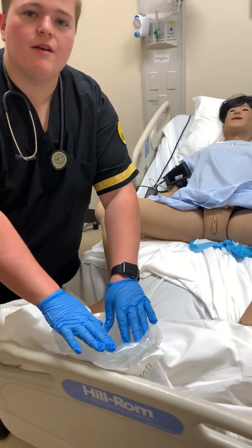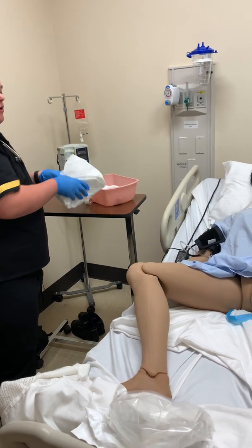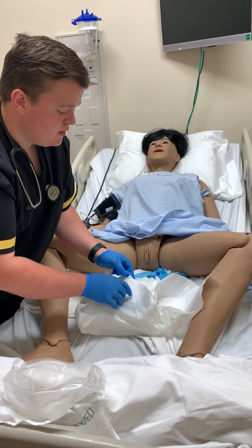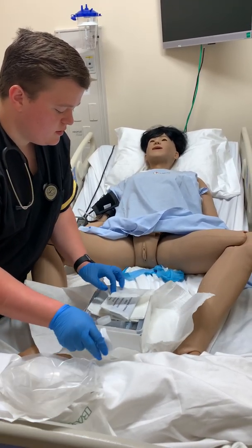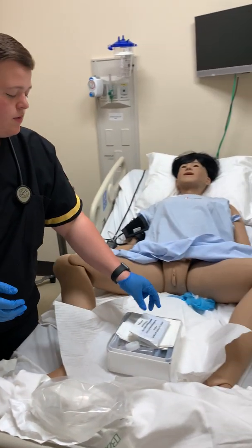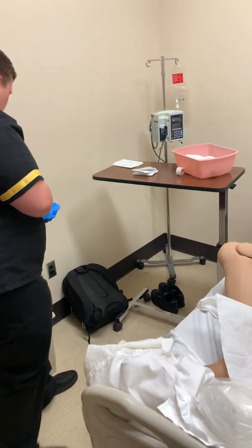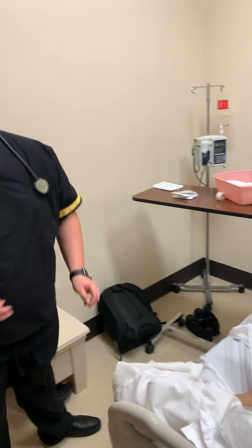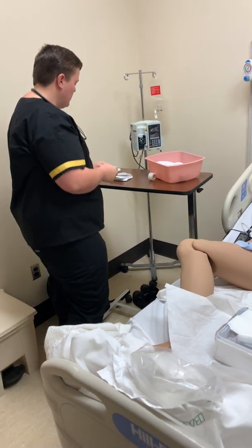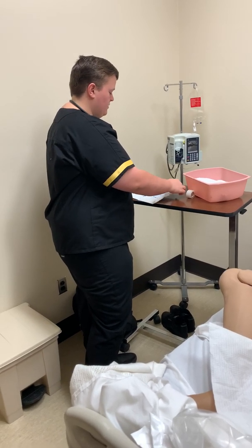We're going to place the bag for our catheter down there to use for trash. I'm going to go ahead and get our catheter kit started, and grab by here to preserve our sterile field. We're going to start our sterile gloving. Go ahead and sanitize again. Everything's clean, and don our sterile gloves.